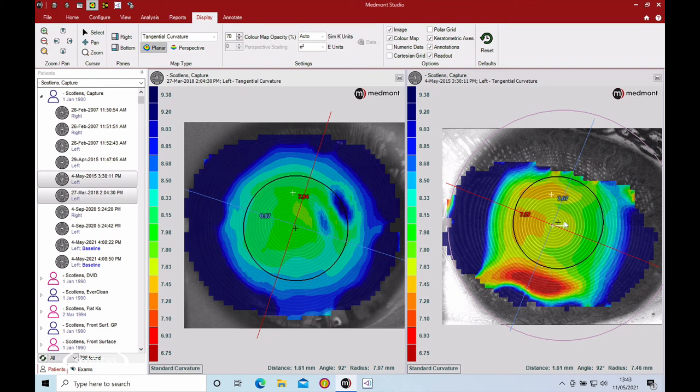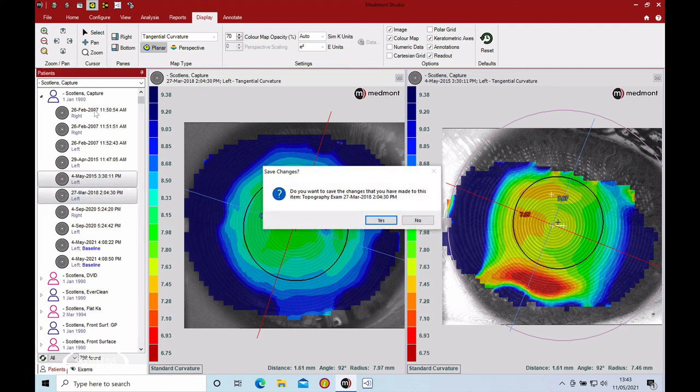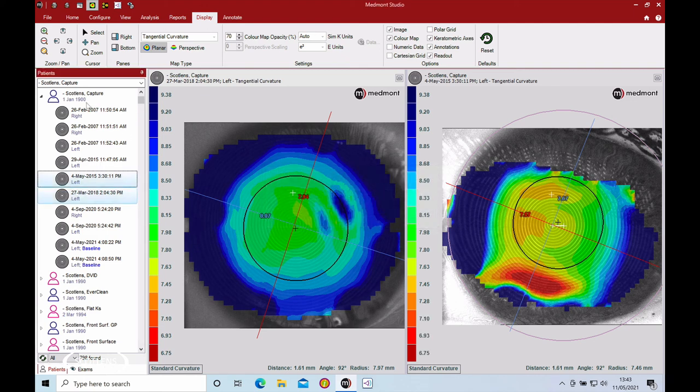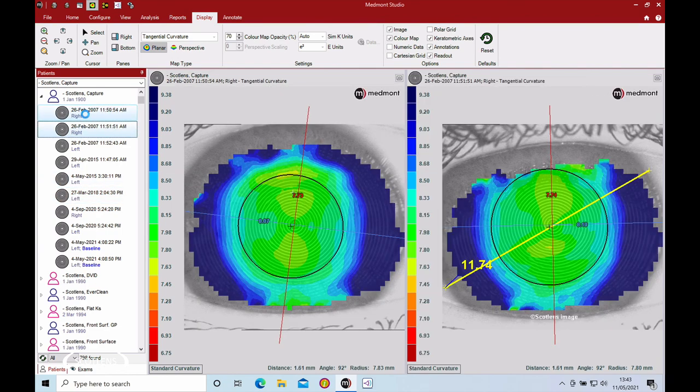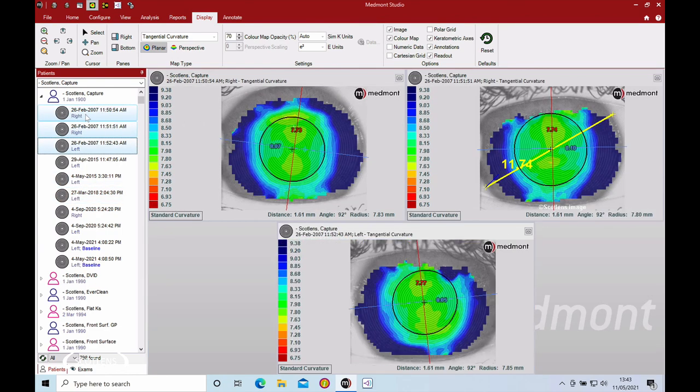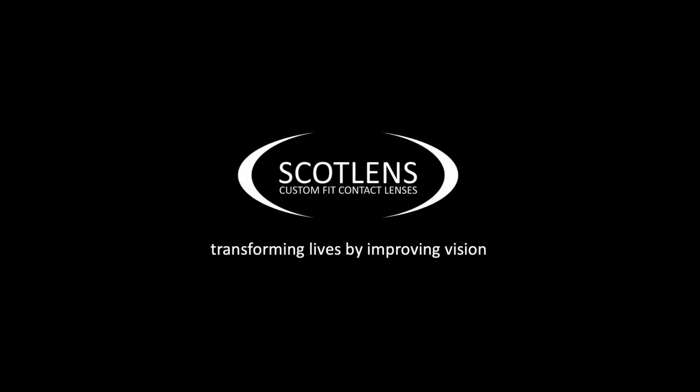So get them to blink, and you can even use a wetting drop. What you want to end up with is nice full images, three images for each eye for your patient, so you've got a good starting point for a baseline, especially for orthokeratology. I hope you found this video useful. Check out our other videos, including the other ones in this series on topography.